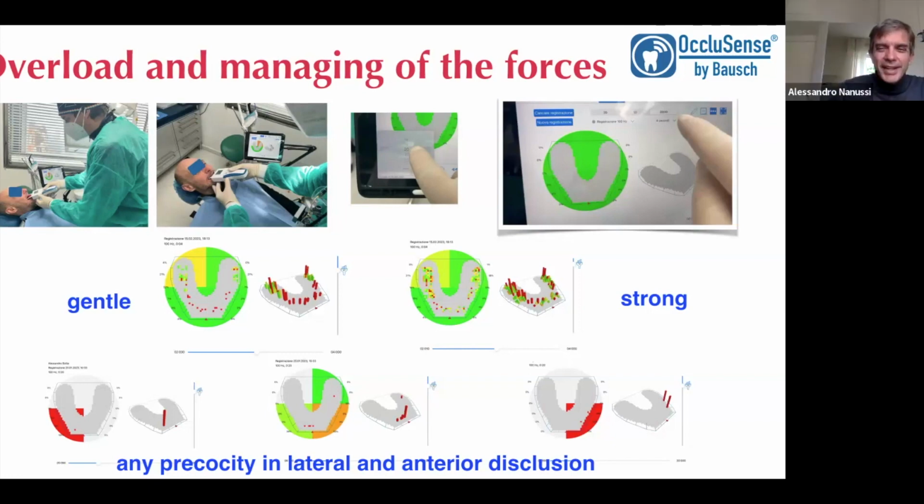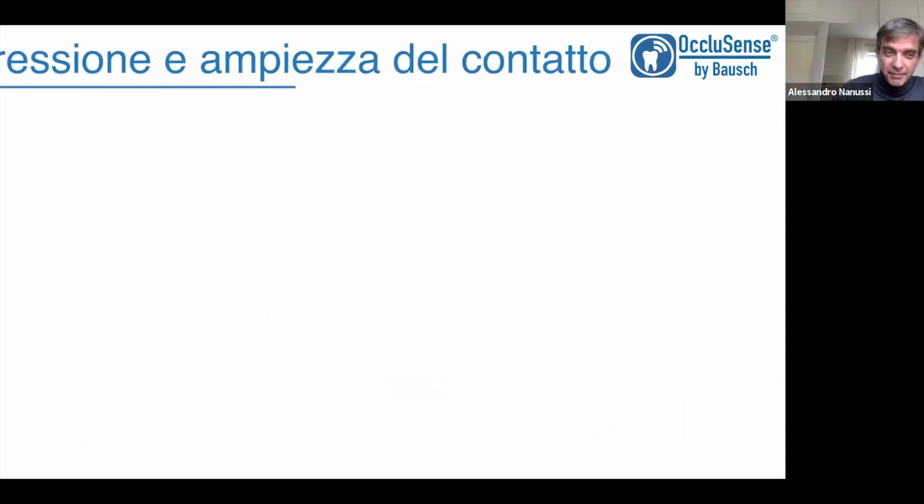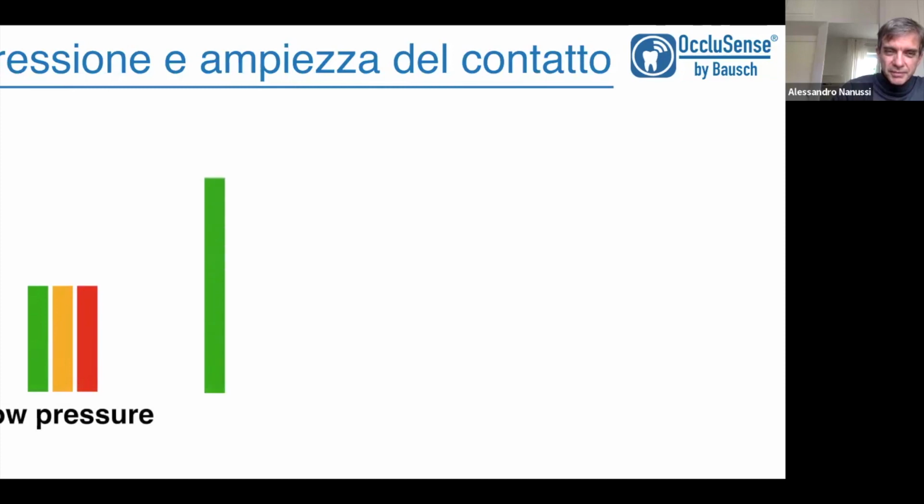Well, in this patient, I've shown you that when the patient clenches strongly, the green areas appear. There is a difference between a patient who shows me only red spikes and a patient who shows me red spikes, but also more areas, green and yellow, like that. What do the colors of the OccluSense mean?